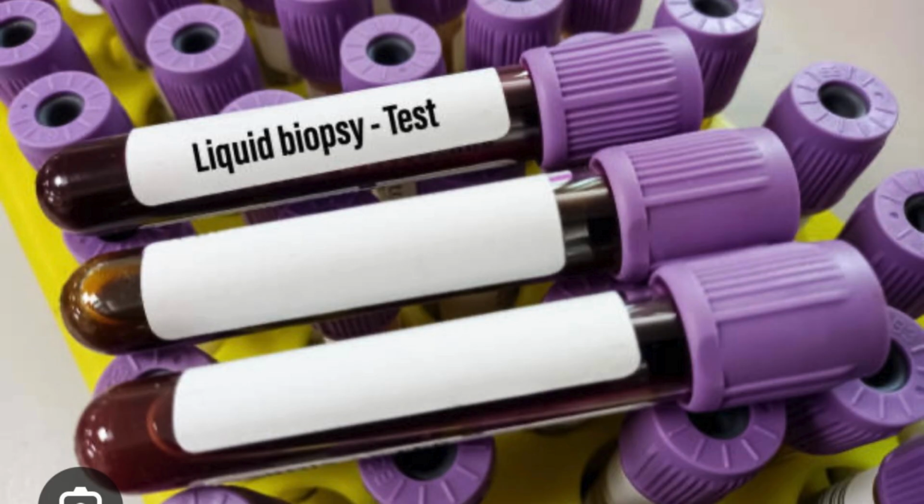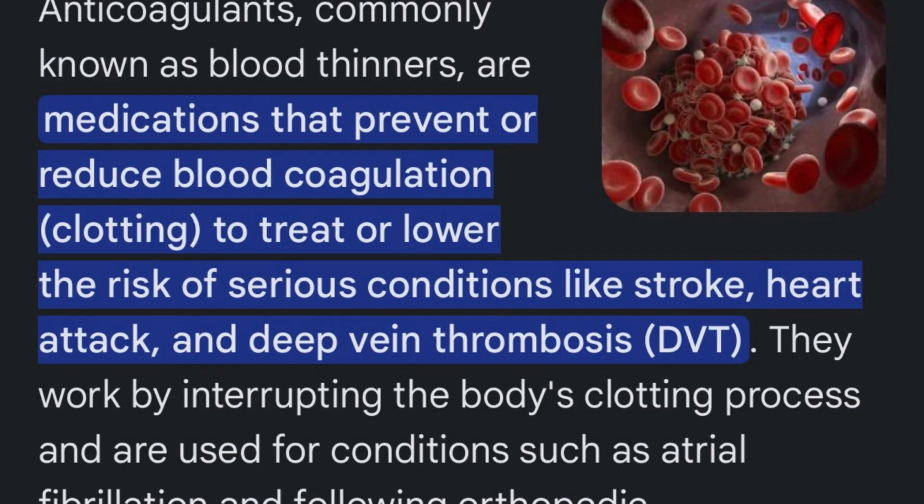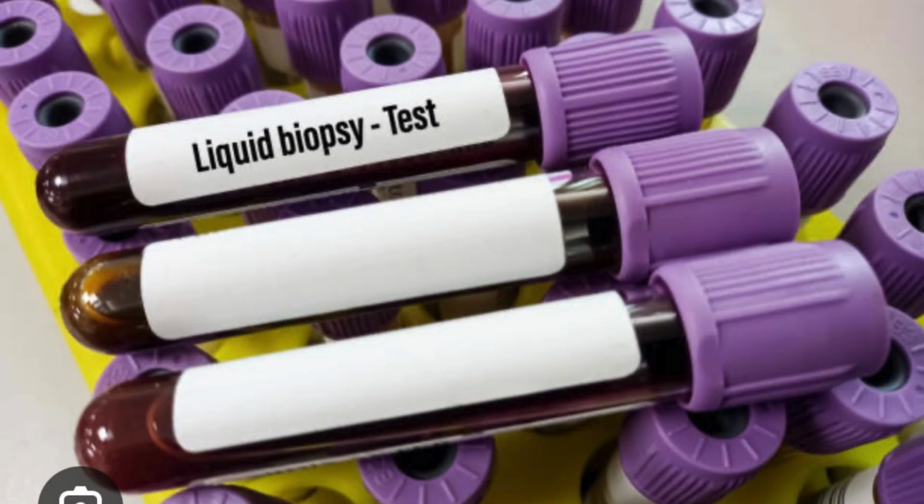For the lavender test tube, the additive is EDTA. The tube is also available with an 8% liquid EDTA solution. EDTA binds calcium ions, blocking the coagulation cascade. Testing should be done within 6 hours after the blood collection.